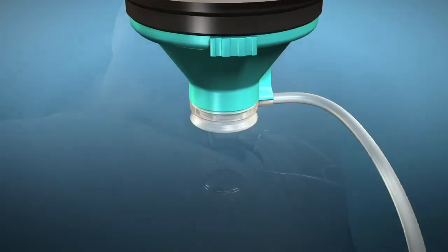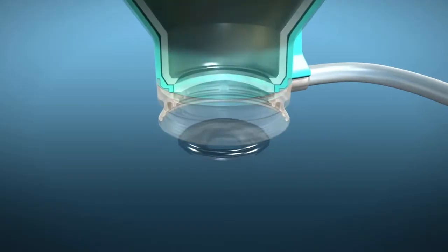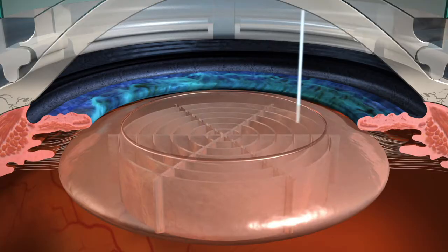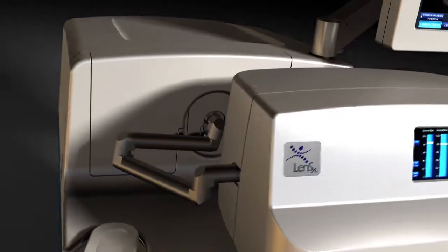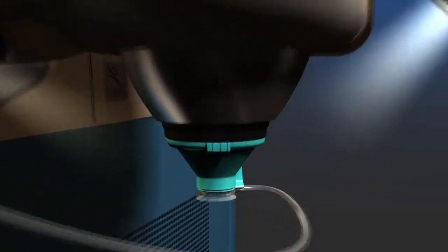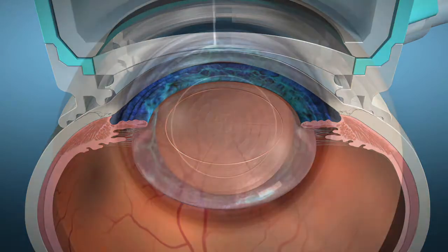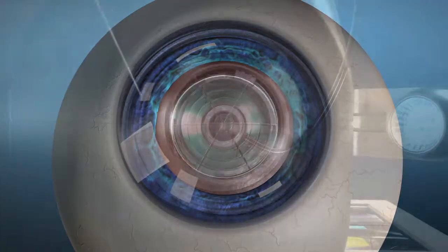With many technology advancements in cataract surgery, surgeons have options that allow patients to make informed decisions on how their cataracts will be removed. One such advancement is the LensX laser. The LensX laser is designed to bring advanced levels of accuracy and reproducibility to cataract surgery, by automating some of the most challenging steps and allowing the surgeon to create precise, repeatable incisions using an image-guided laser.